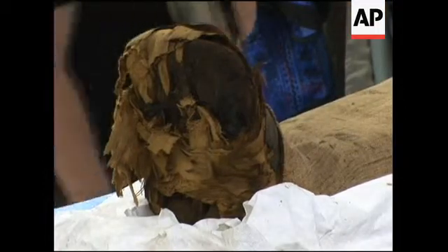Before we do anything, how far off are we? Did we see how far off the mummy is off the table?